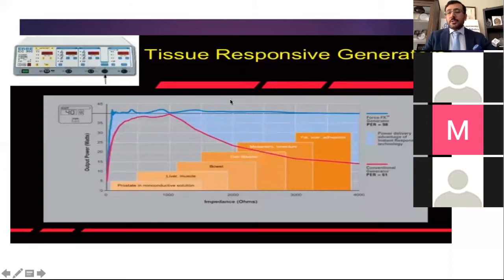So just imagine, this power is very important, and you must know about this and adjust this. Unfortunately, I was witness in two cases, so newborn for this circumcision, and I remember one time when I was a student, one of the neonatologists, she was doing this circumcision in one day baby, and just you can imagine what happened. Because she didn't control the power of the cautery completely, so the cautery took that penis and finished within just 1 second. So I never forget that, and so be careful.